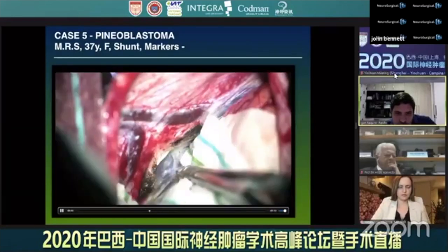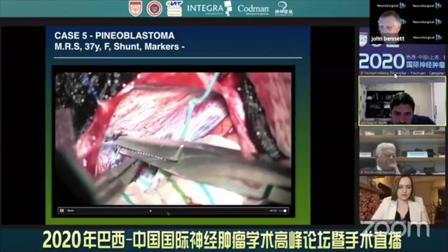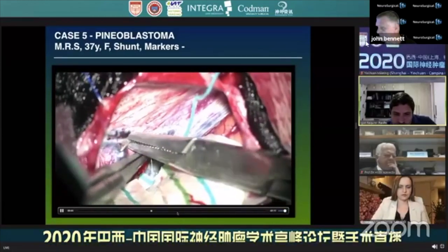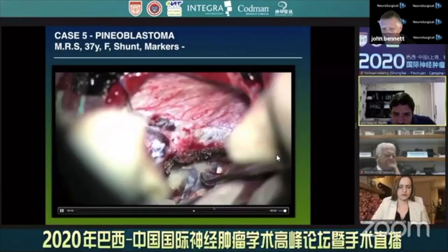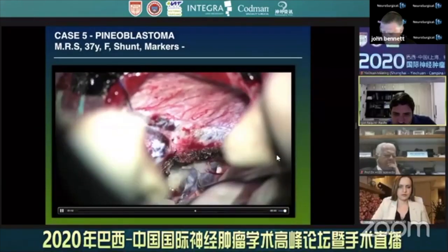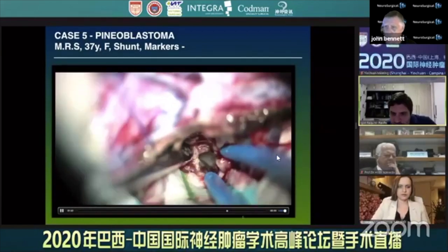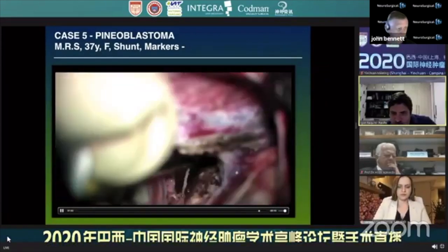Some dural stitches in order to expand the corridor and have a better view from the other side. And here you can see the dense and opaque arachnoid. So, gentle movements, we start to break the tumor. We start to coagulate. By the end, you can already see the third ventricle. And a gross total resection.